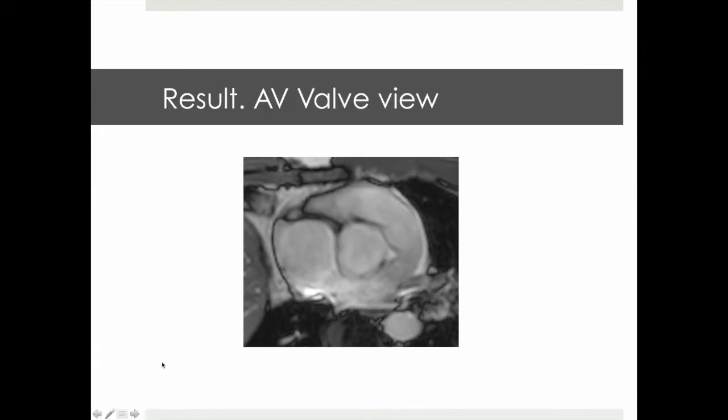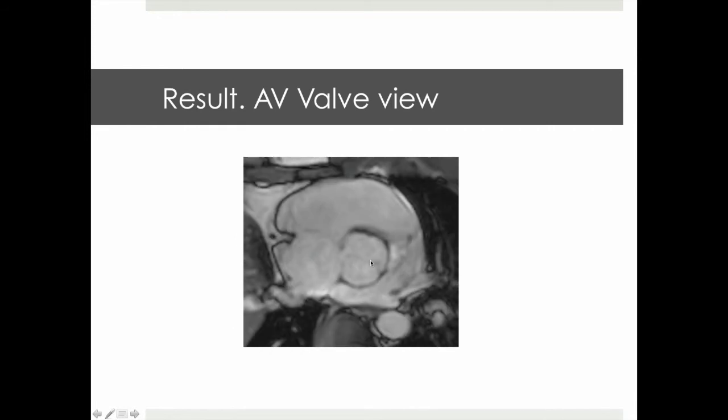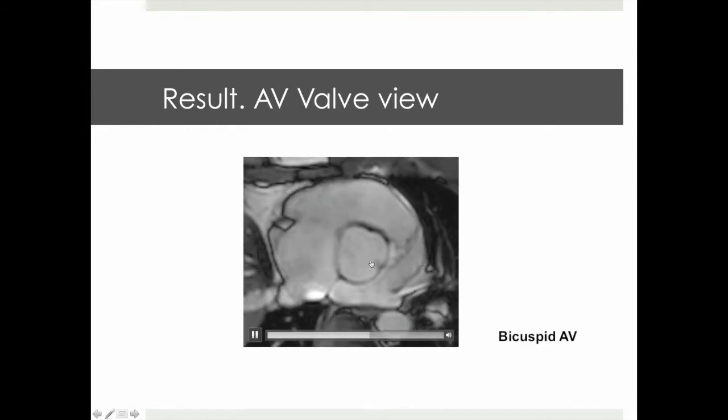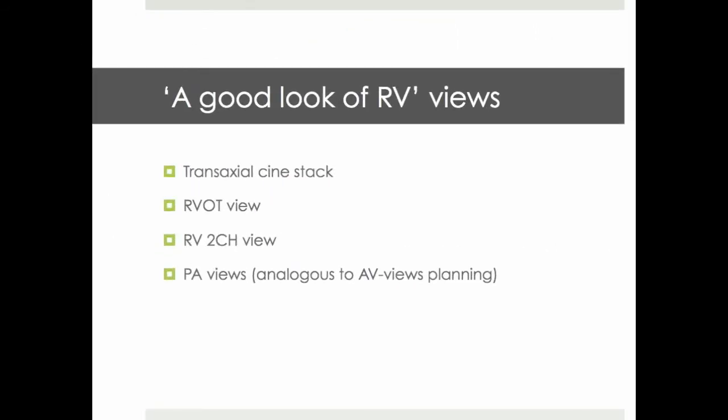And here is our result, aortic valve view, allowing appreciation of aortic valve opening as well as its morphology, in this case being bicuspid aortic valve.